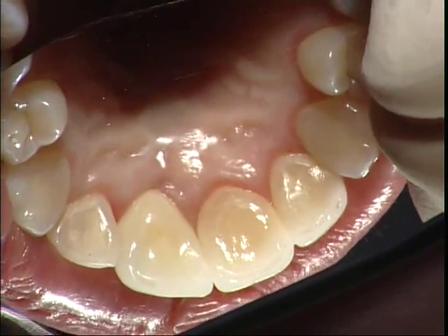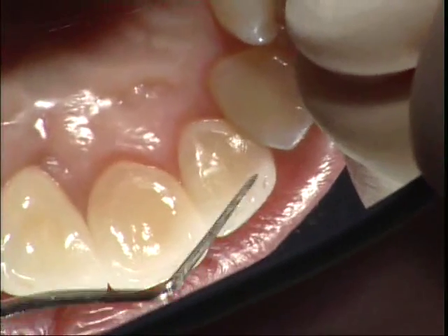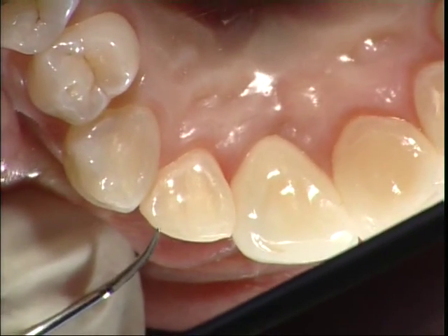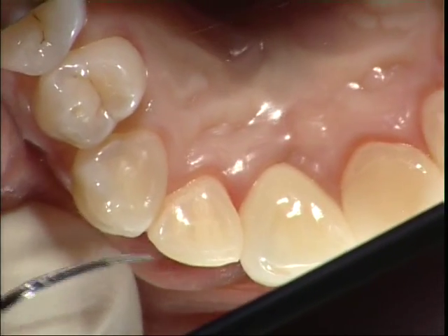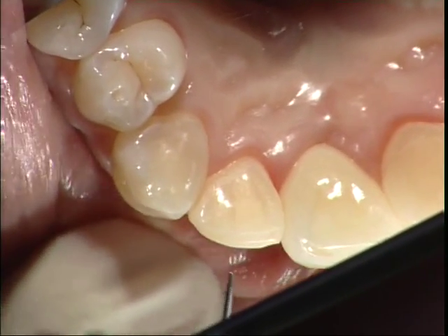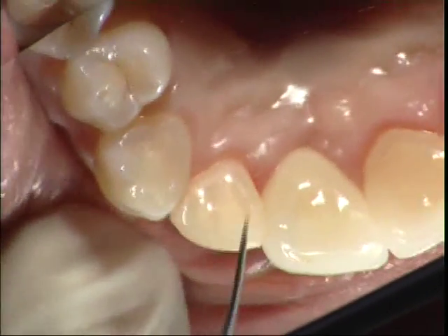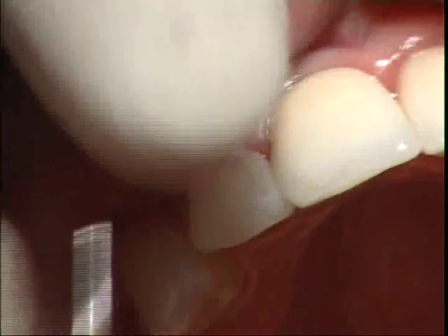I think I removed enough here now to be able to get about the same anatomy as I have on that one. If I gave it a chamfer here on the inside, this would be too sharp in this area. So from the buccal you can see the finishing line. The cervical finishing line is very shallow. The reduction on the incisal could be a little bit more — it doesn't really matter — but I am still in enamel.